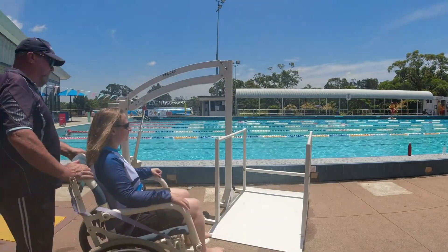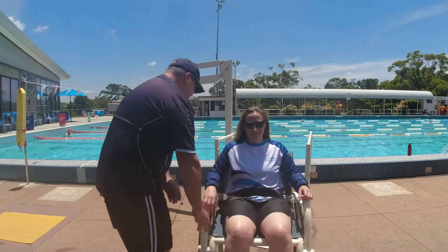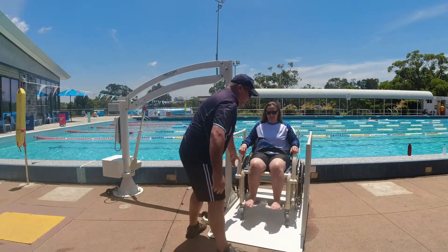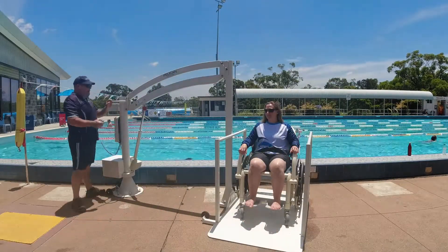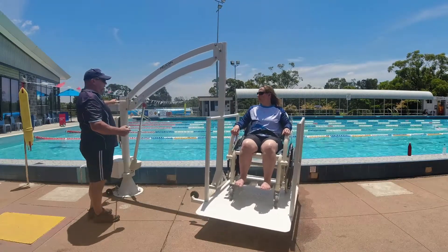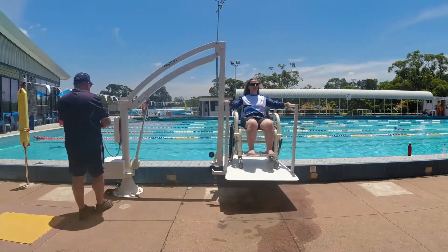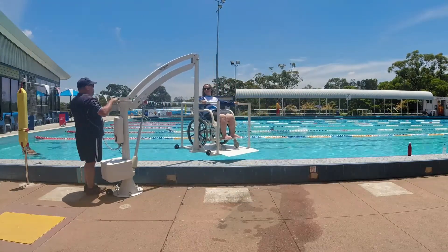The second option is for the person that is not mobile and requires an aquatic chair to assist with their safe entry and exit. Depending on the person's ability, they may transfer into the aquatic chair using a ceiling hoist in an accessible change room and then travel to the pool site, or they may transfer from wheelchair to aquatic chair at pool side. It's important to discuss the best option with primarily the person, or their carer if required, as they would have a normal routine designed around their ability.